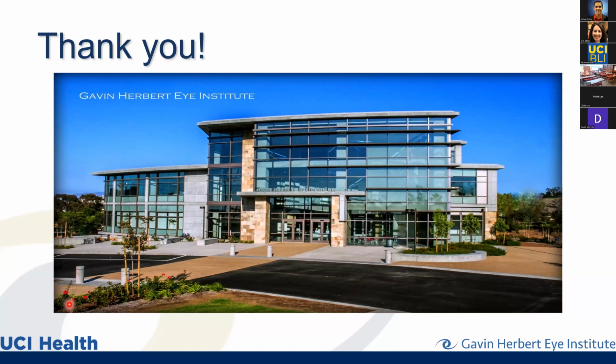So yes, we could. I usually have been thinking that some of these confocal changes probably take months to change. So we've been doing them every 3 months, with my assumption that it would take that long for the dendritic cells to go away, or a very long time for the nerves to grow back. I think I could very well be wrong, because we saw the nerves grow back in that oxervate patient 4 weeks later. Of course, that's with a recombinant nerve growth factor, but still, we have only been doing them every 3 months because of my assumption that it wouldn't change. Should we do it more often? Sure. But within the same day, I don't know.